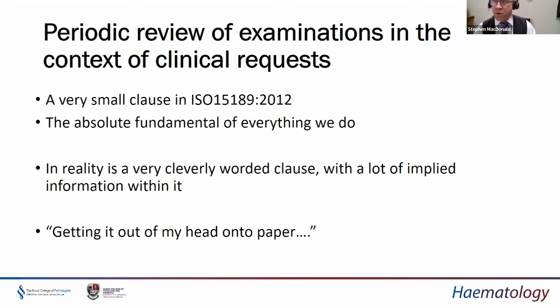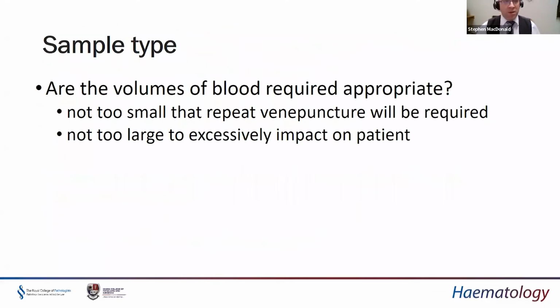How do I periodically review that every test result that goes out of the door of my laboratory is valid for the purpose that it's been requested for? And that's very, very important. And what we'll do over the next few slides is we'll walk through some of the things that we need to consider as part of that.